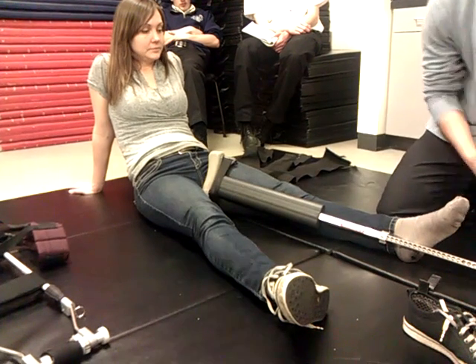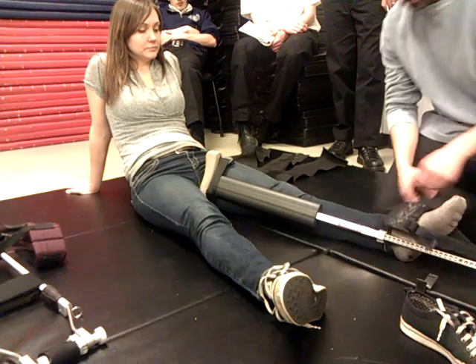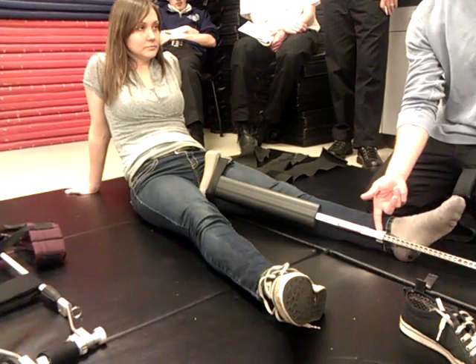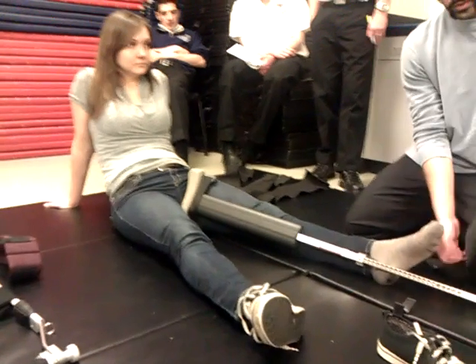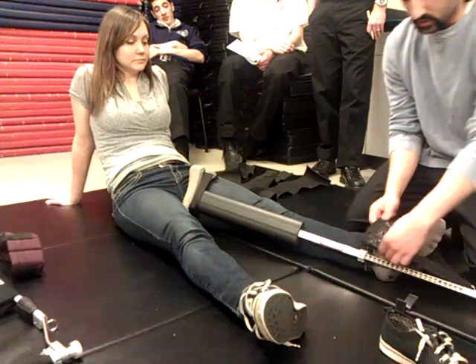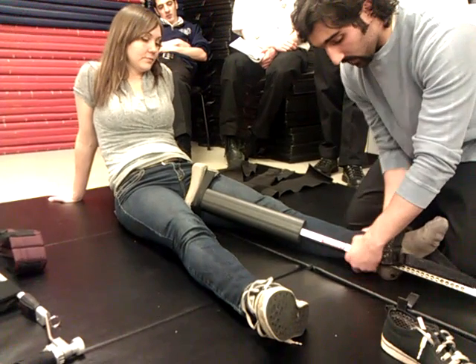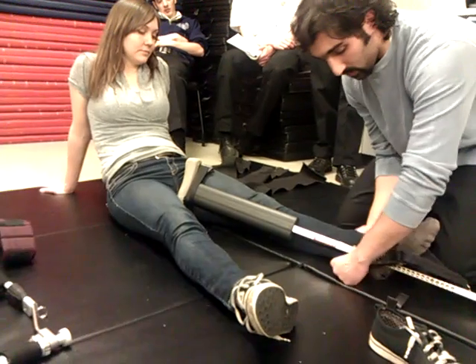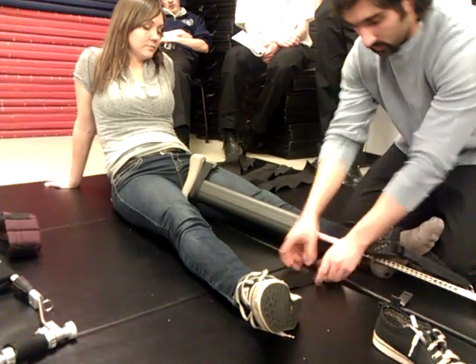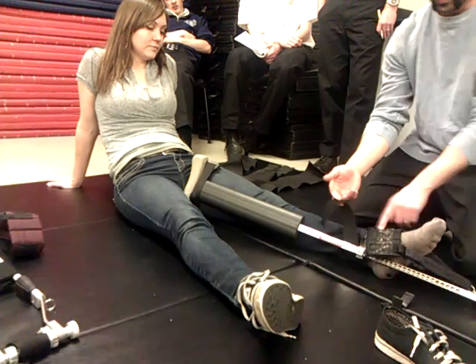It's pretty much the same concept as before. You're going to have the hook, which is going to go over on top of the leg. You're going to slide the strap under the leg, but this time you'll notice how close the device is to her ankle. You don't want the strap to go over the device. You want the strap to go under the device. So you're going to slide that over the foot, and you're going to be careful to not move the leg excessively. You're going to slide the strap under the Achilles tendon, and pull the strap up in between the device and the leg.